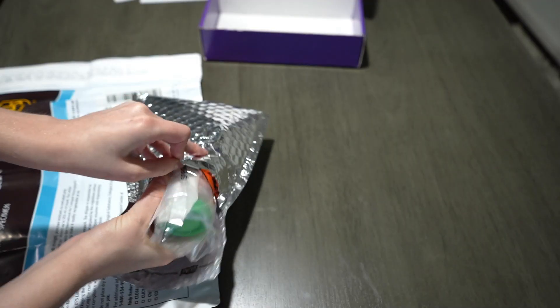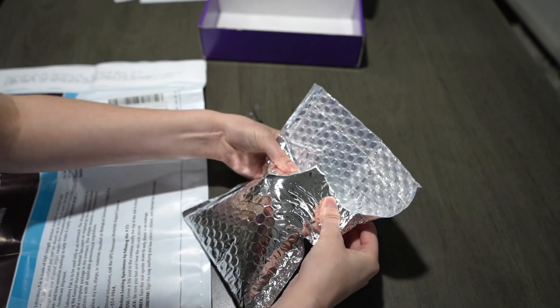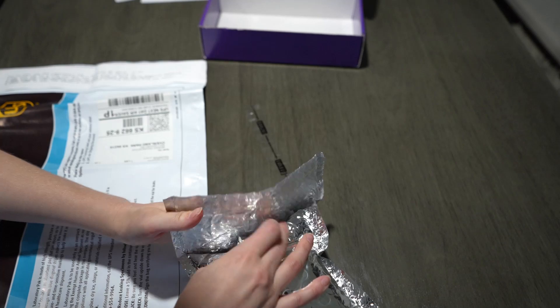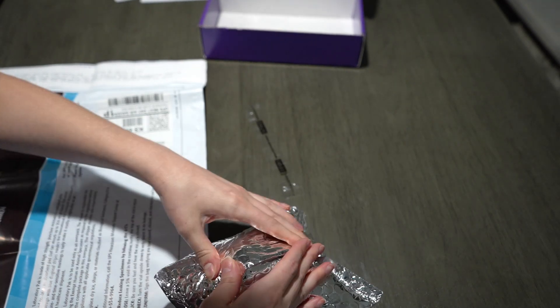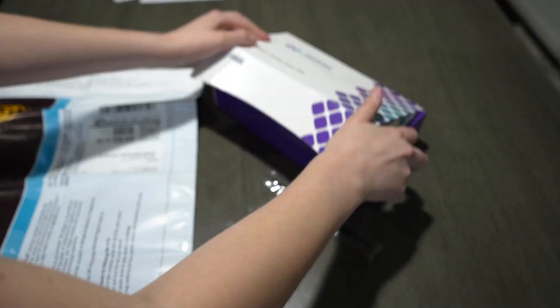The ice pack does come with the kit and you need to freeze it — overnight the night before, or at least for four hours. You also want to freeze the urine sample for at least four hours or more. Then you're going to put the frozen urine sample in the insulated envelope, and then put that back in the box it came with.